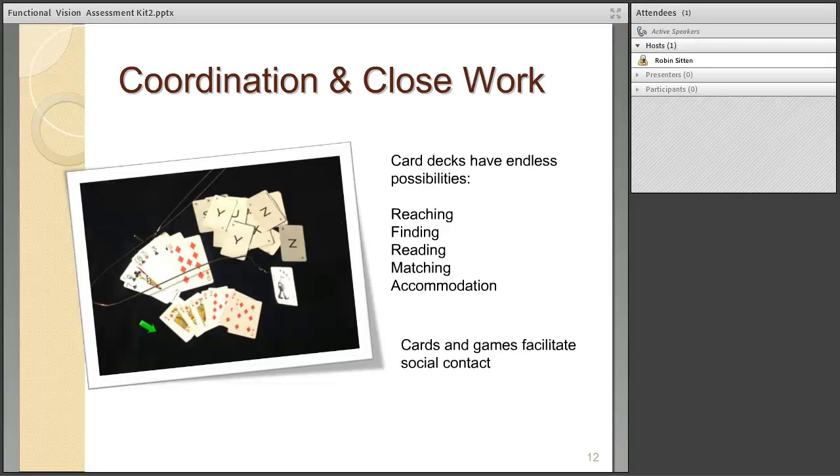Note these letter cards pictured here. These are from a board game called Probe by Parker Brothers. A single game has about 100 of these cards. The letters are about 8M, and being able to separate letters from a visual chart can open up the creativity of your viewing tasks.